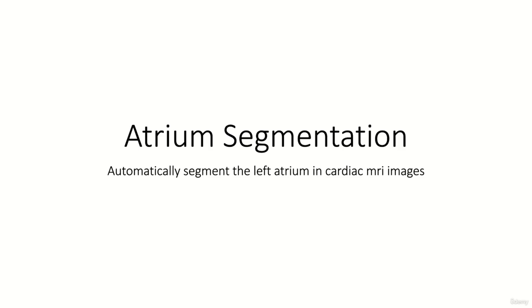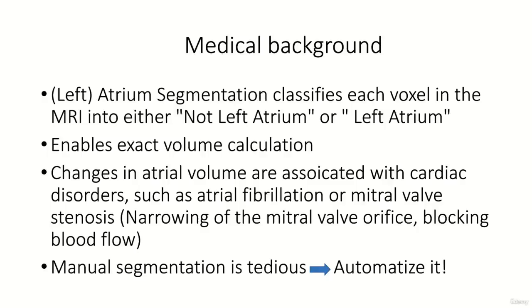Hello everybody and welcome to the introductory lecture of our third project. In this lecture series, we will build a neural network which will automatically segment the left atrium in cardiac MRI images. As usual, let's talk about the background first.